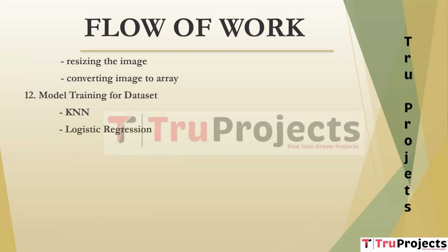Logistic regression. It is a simple yet effective classification algorithm that models the probability of a data point belonging to a particular class using logistic functions. It is chosen for its interpretability and efficiency in binary classification tasks. Voting classifier. A voting classifier combines multiple machine learning models and aggregates their predictions to make a final decision. It is used to improve overall classification accuracy by leveraging the strengths of multiple models. In this context, it combines the predictions of KNN and logistic regression for more robust results.